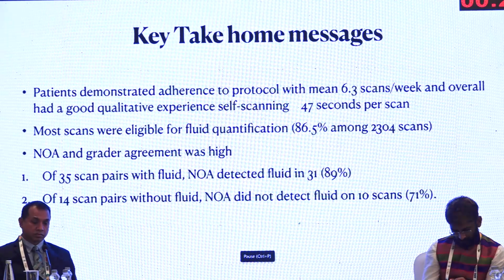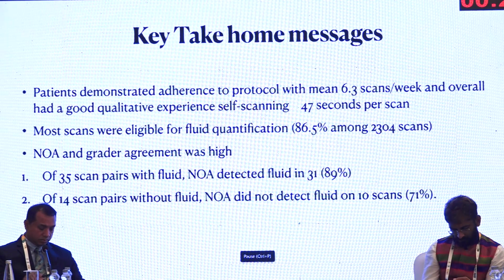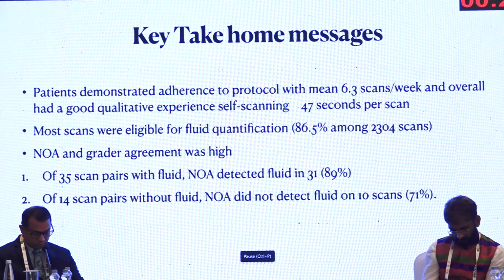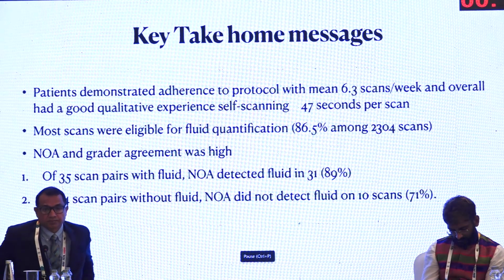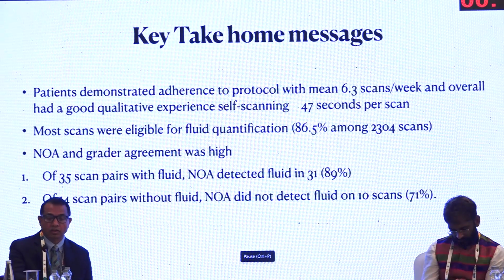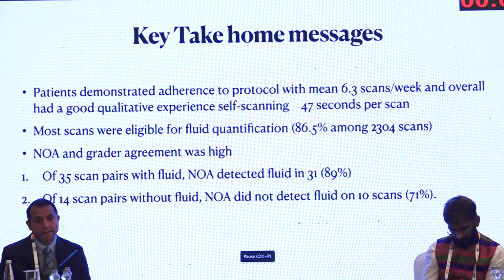So it demonstrated the adherence, meaning the requirement is that every day the patient should do a scan, and there was reasonably good adherence to the scan. About 6.3 scans per week was achieved. Each scan took nearly 47 seconds, that is less than a minute. Most scans were eligible for fluid quantification, nearly 86.5%.